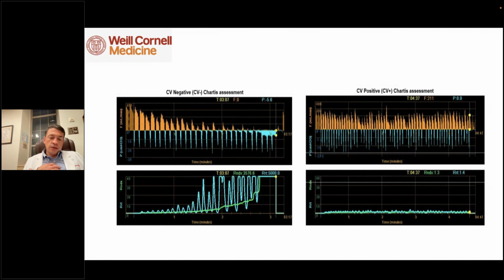My own biased opinion, my own personal opinion, is that this is a very important part of the procedure, because we have seen over the years patients who had collateral ventilation detected on this that had fissures more than 90%, and vice versa. Patients with fissures less than 90% who did well with valves because they had no collateral ventilation. But it is a discussion, and you may see that variability.